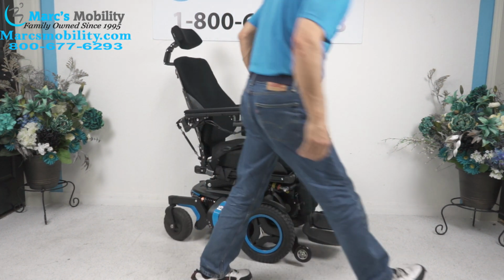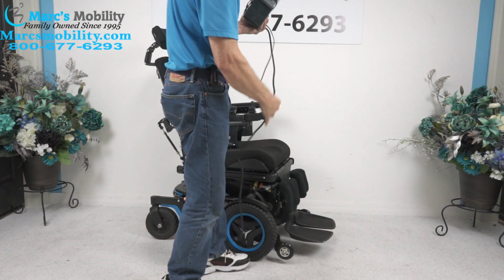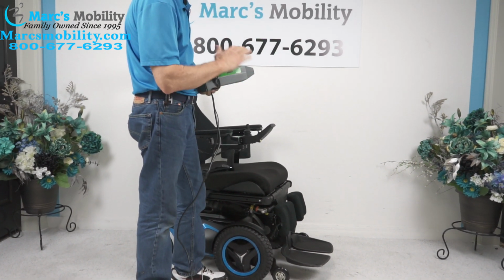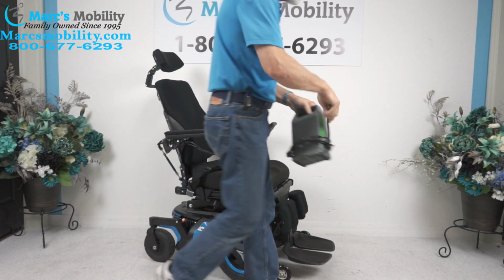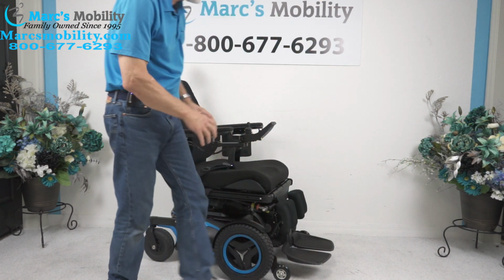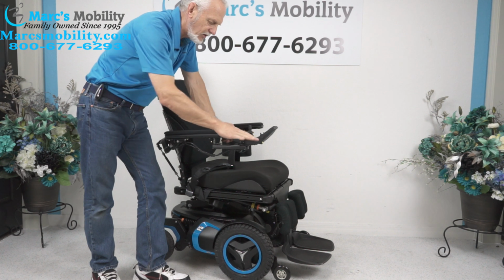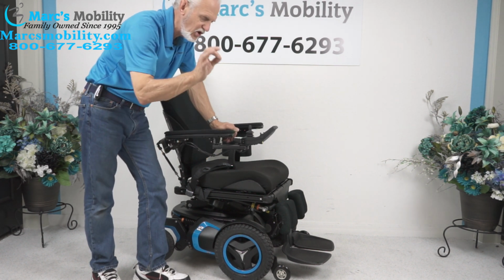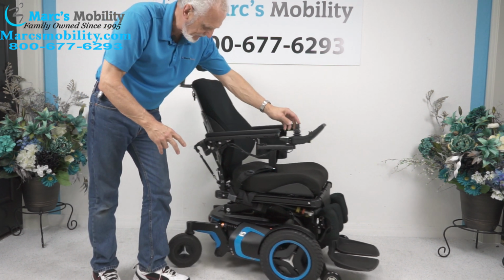When you charge this chair, you will take your Permobil charger and plug it right below your joystick, right here. And as soon as the light goes to full, the charger will stop charging. These are smart chargers, they know when to stop. This chair will go about 15 miles on a battery charge. Now, that all depends if you are going uphill, if you're in the grass, how many of the functions you use, the weight of the user. So you might get more, you might get less, but it's a good number, 15 miles on one battery charge. There's two batteries in here, okay?